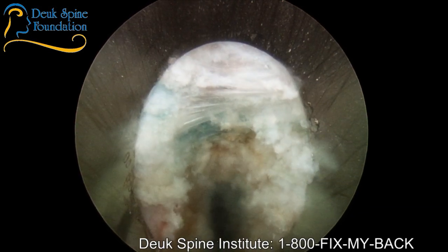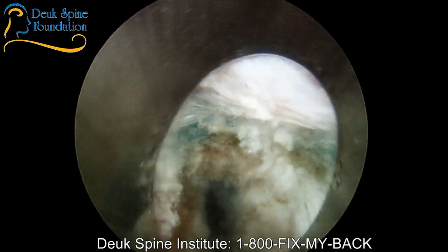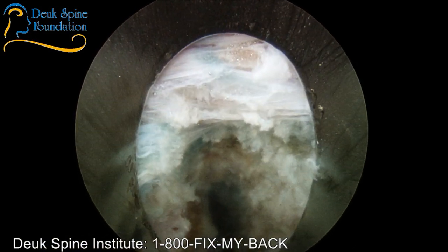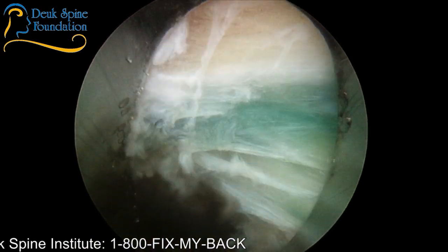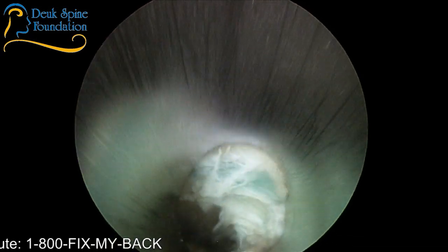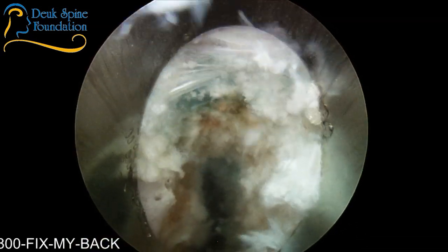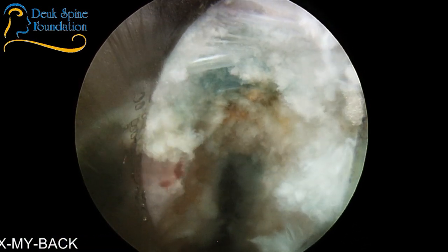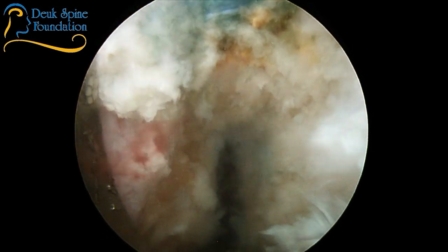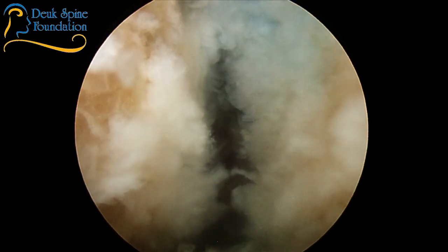All right, standby laser. So we're going to come out. There's our fat, epidural space. And if I look north, we should see a nerve root up here. And there it is inside the fat right there. And that's where the herniation was, and it's gone. I might get a little bit more of that. Let me have that laser. Any more questions, Zach?